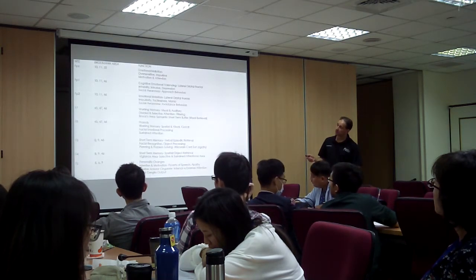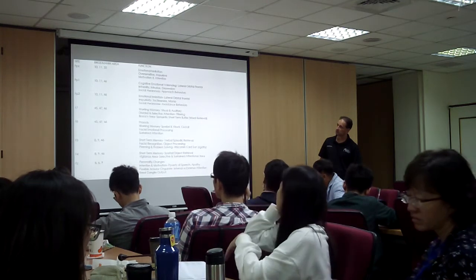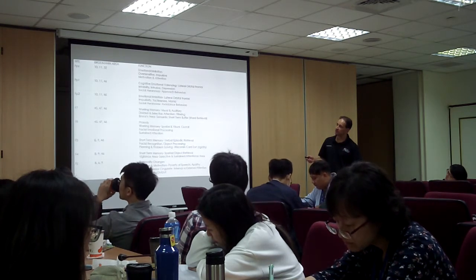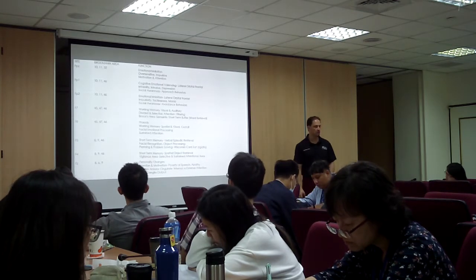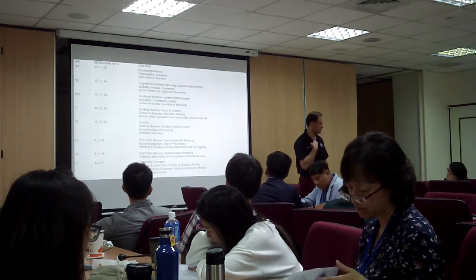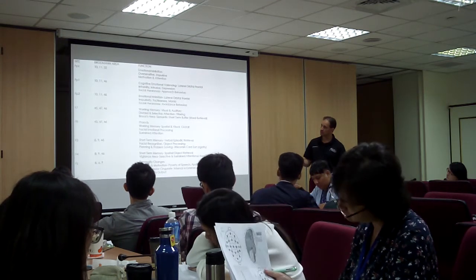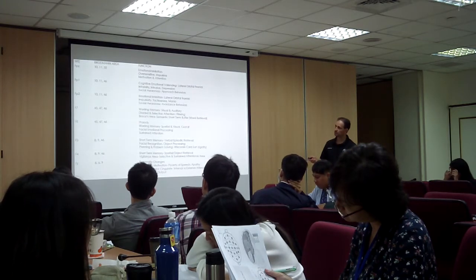Now, here we have it in a more detailed manner. So, what do you train at FPZ? You train 10, 11, and 32 for emotional inhibition, being oversensitive, impulsive, motivation, and attention. So, all those people who are quick to react. You tell them something and they think they're being personally attacked, they benefit from FPZ or FZ training. Those are the Brodmann areas and functions that you're training, okay?